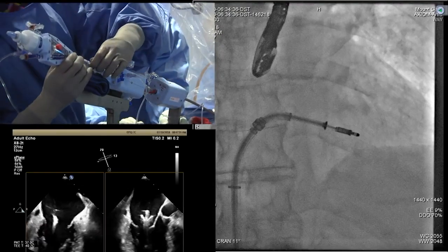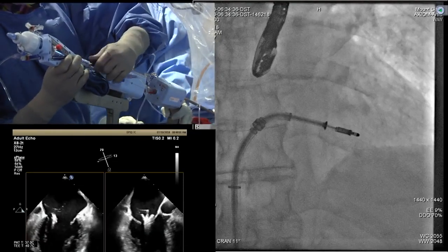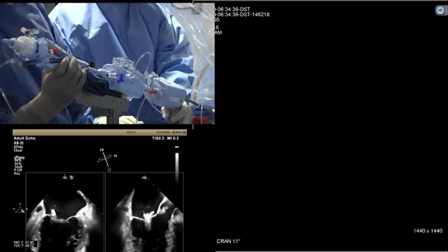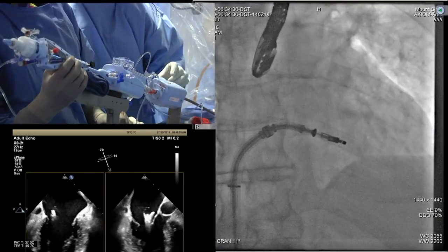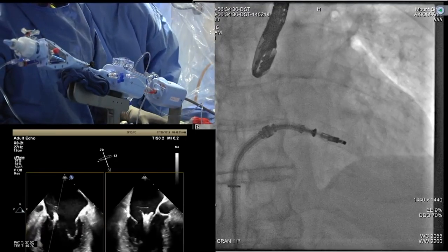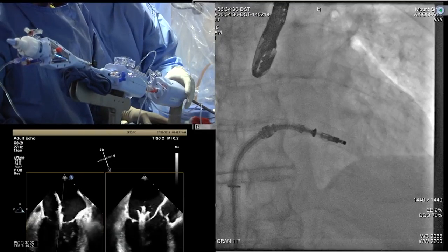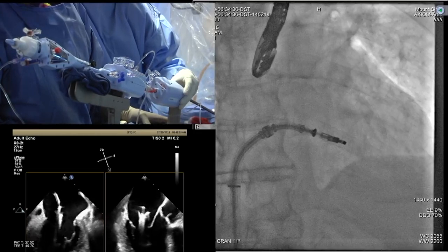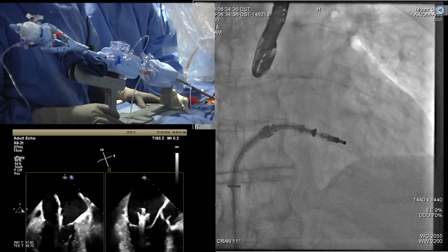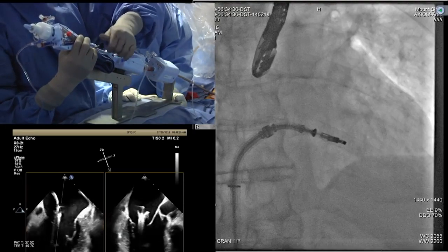Then let's come out. I cannot do any more pullback. No, no, you can. Okay, good. We pull the guide out. Yeah, that's good. Yeah, push in the whole delivery. So we are on the middle. I'm pushing in. Good. Central now? Okay, Gila, we are good? Yep. Do we enter the LV? Yes. Okay, I'm going in now. So same DC handle, you release the knob. Check the pins and I'll go in slowly.